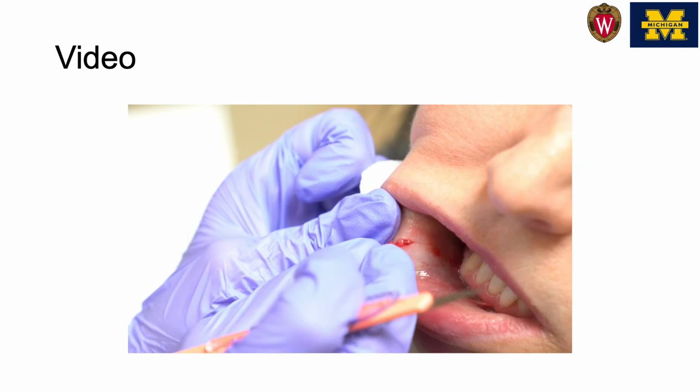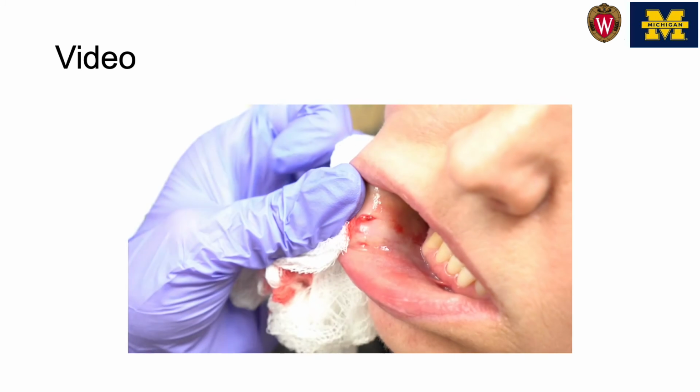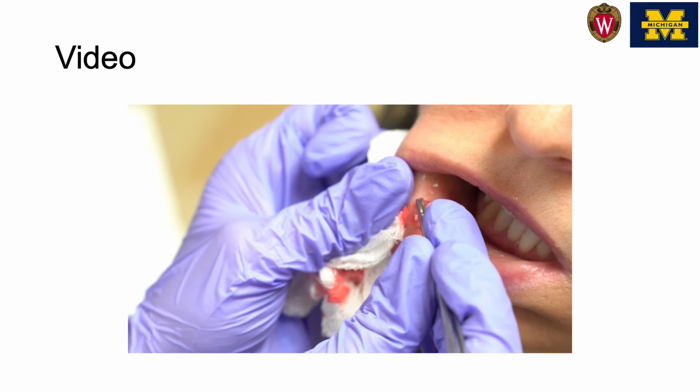You can see that I'm pointing out an additional gland I could see by moving the window. I'm just releasing a little bit of connective tissue there, and we're going to remove another labial salivary gland.